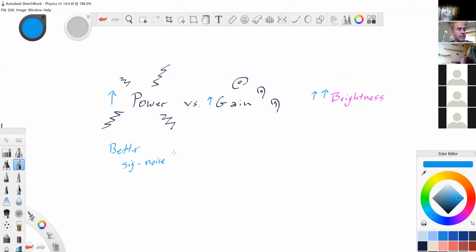If the image is too dark, first increase the receiver gain, which does not increase patient exposure. That's important. That's kind of like an SPI question. If he gives you an image that's too dark, what's the first thing you do? Gain. If the image is too bright, decrease the output power.